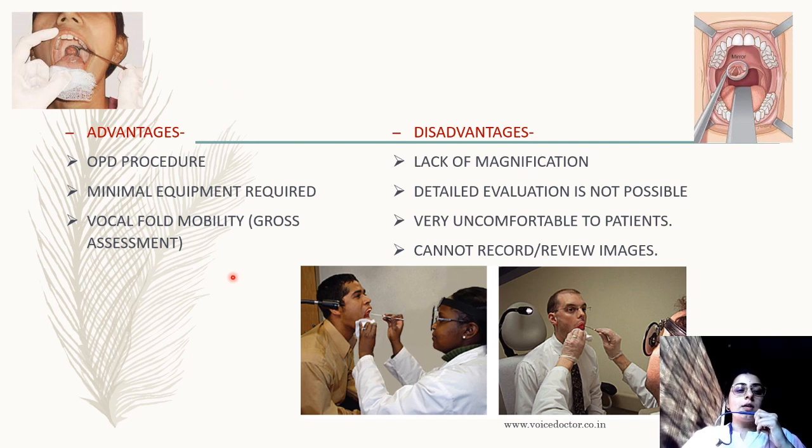So the advantages are mainly that it is an OPD procedure. You can perform it right there and then. It requires very minimum instruments. You can easily check for vocal fold mobility, and you can have a gross view of the larynx. But it does come with certain disadvantages.